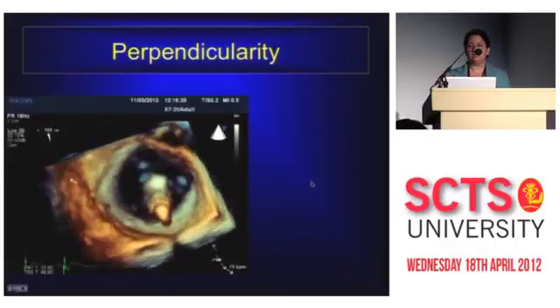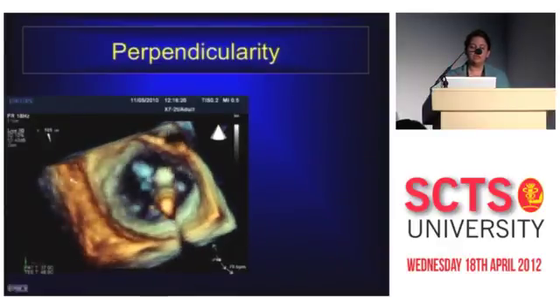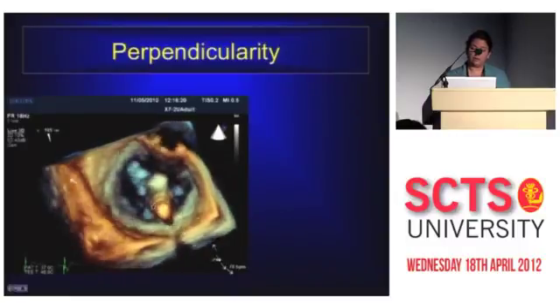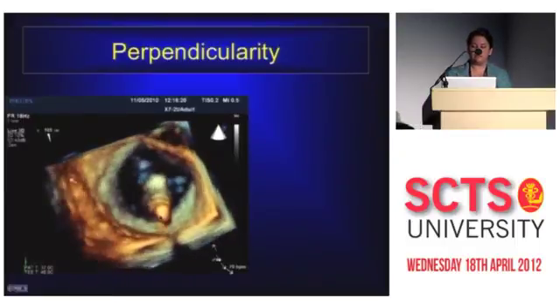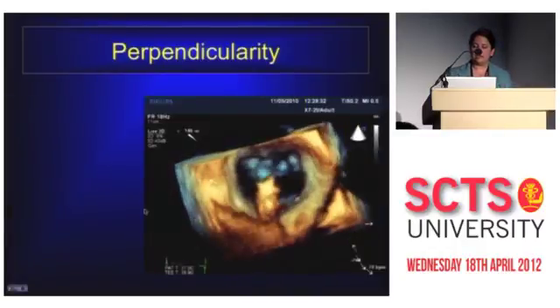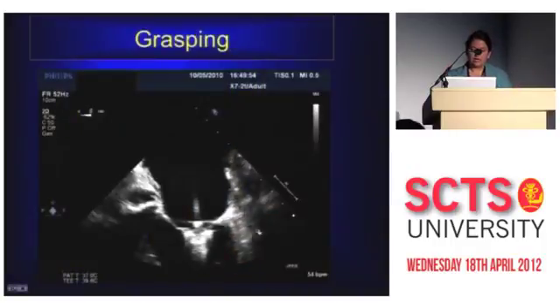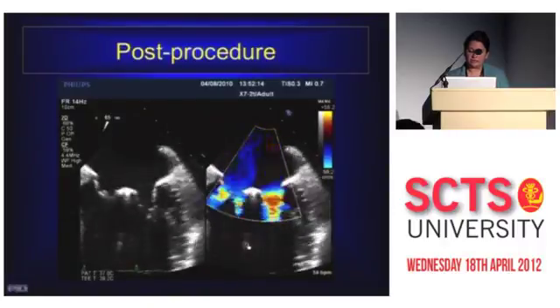Now, 3D echo has an additional advantage over 2D echo because you can look at it from a surgeon's eye view. This is a surgeon's eye view that most surgeons will recognize, with the anterior leaflet up here and the posterior leaflet down there. And we're aiming for a central jet. When the clip arms are open in this particular instance, the arms are not particularly perpendicular across the coaptation line, but you can steer it live, and you can get the arms perfectly perpendicular to the area of interest before you start grasping. Grasping is usually done on 2D because I don't think resolution is good enough. Okay, so here's a clip in its final position with reduction of mitral regurgitation.